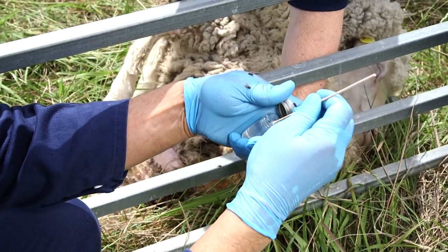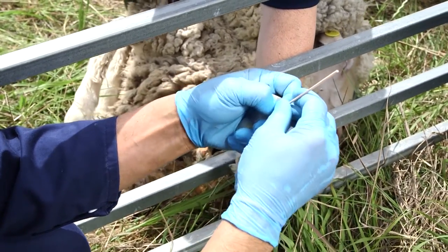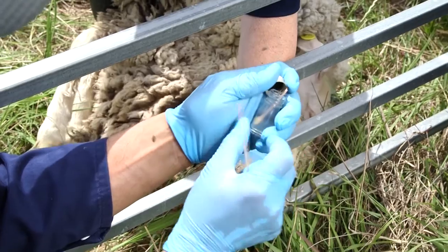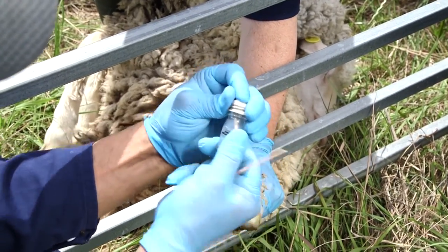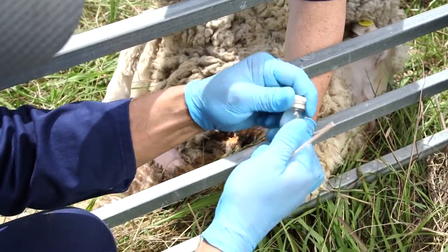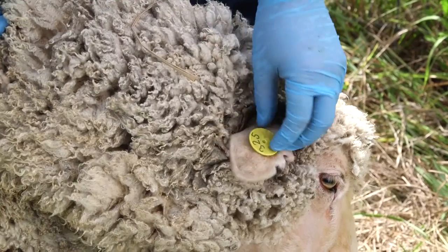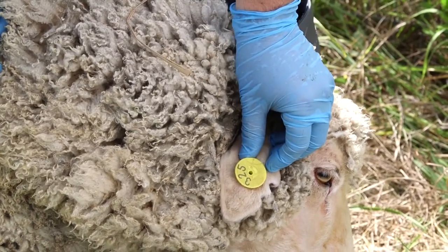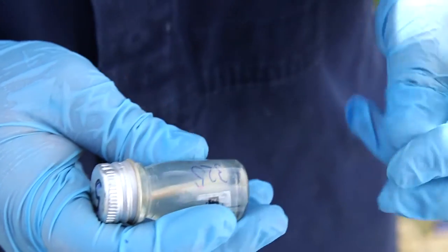Insert the swab as far as possible into the transport medium before breaking off the stick. Make sure a small length of the stick remains above the surface of the medium. Replace the lid of the transport media and screw down firmly. Then label the bottle clearly. A new swab must be used for each foot sampled.